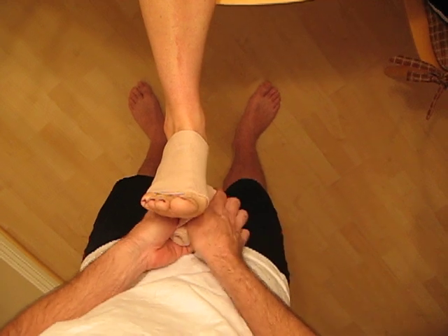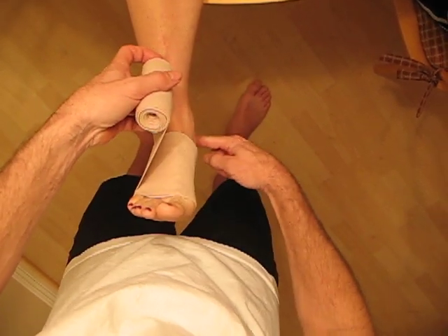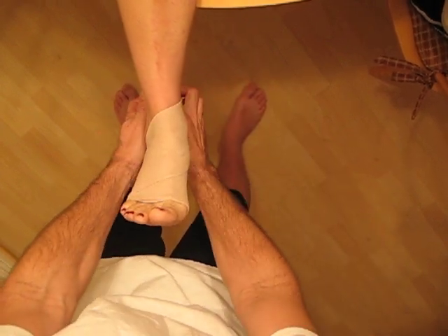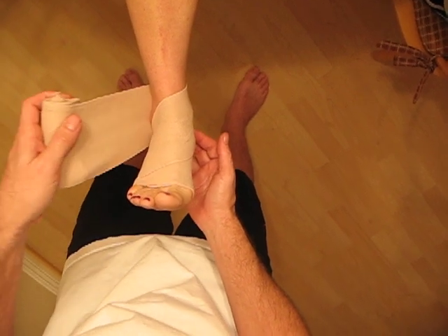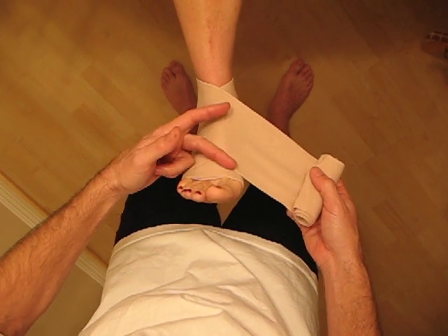Once I go around, come up, and instead of spiraling, this edge is going to be right above the heel. So I come up, this time above the heel, and then I work my way back down and over the foot.